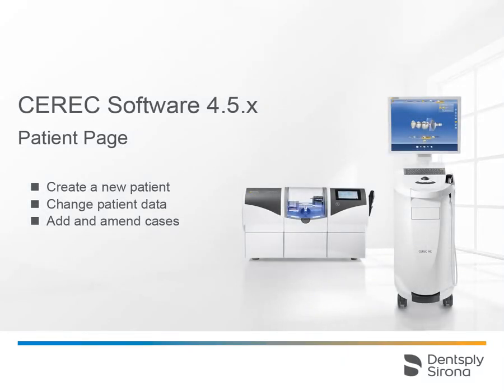Welcome to this video tutorial on the topic of the patient page. This video will show you how the patient page is structured and how to create new patients and cases, as well as how to modify data.